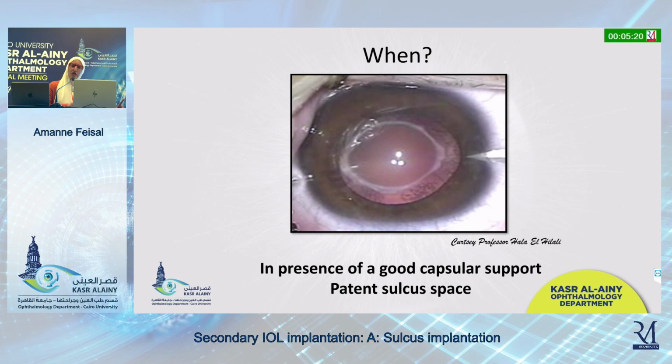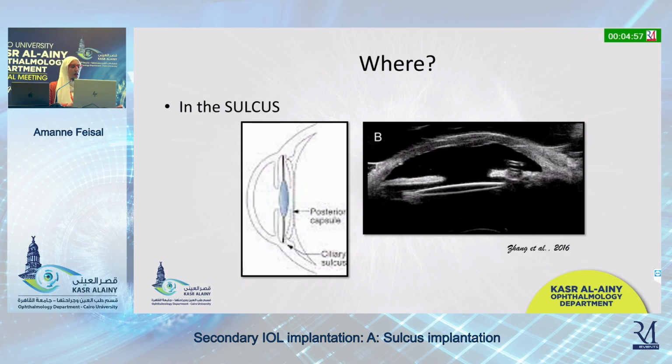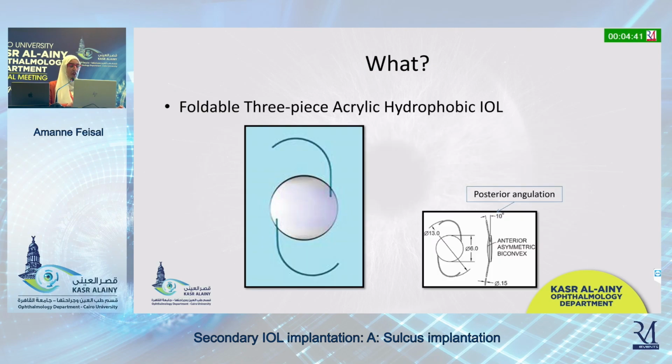It's not necessarily 360 degrees, but as long as you have good support 180 degrees apart, it's quite good. And we have to have a patent sulcus, meaning that we don't have posterior synechia or lens matter that is retained that will cause any decentration of your IOL when you implant it. We implant the IOL in the sulcus, that's to say, between the posterior surface of the iris and the capsular complex, whether it be the anterior capsule alone or the anterior and posterior capsule, regardless of the condition of the posterior capsule.